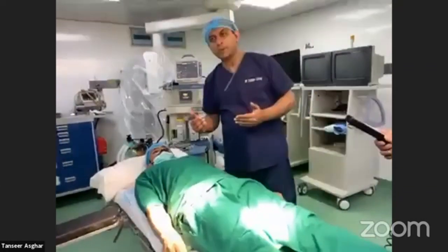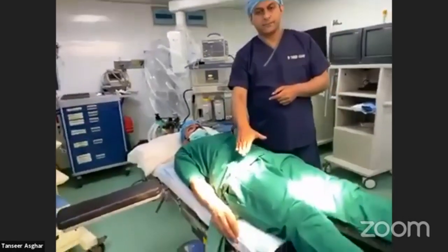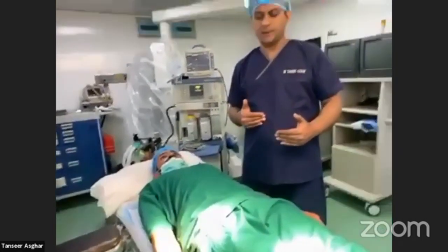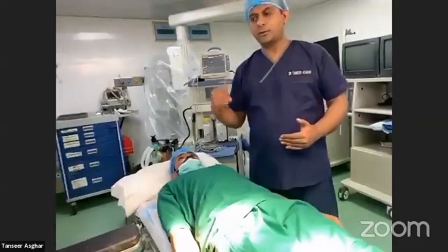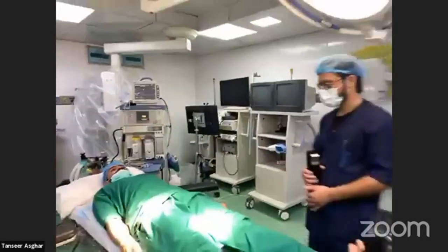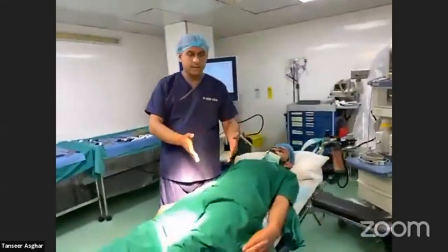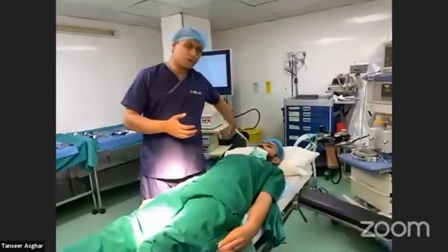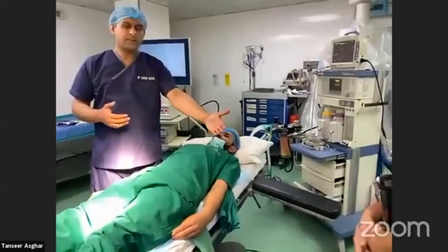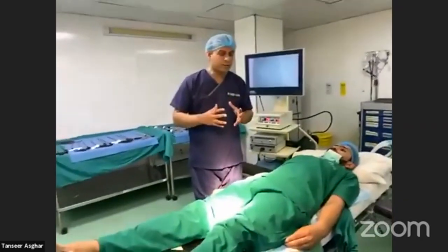For laparoscopic inguinal hernia — right-sided — the surgeon stands on the left of the patient, places three ports, and the assistant holding the camera is on the right side. For a left-sided hernia, the surgeon moves to the right side of the patient, with the cameraman on the left and the assistant on the left of the patient as well.